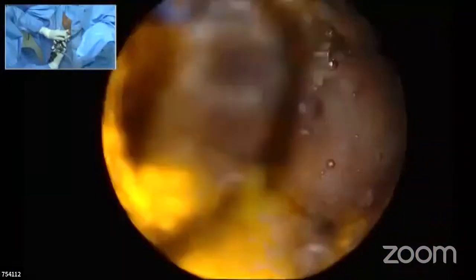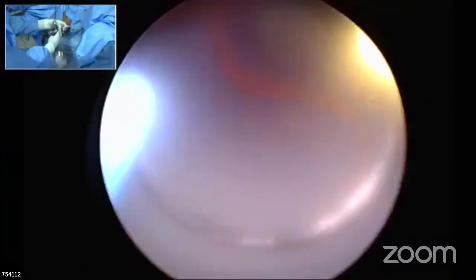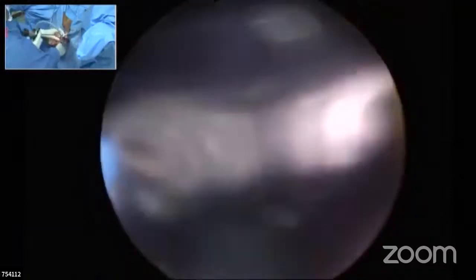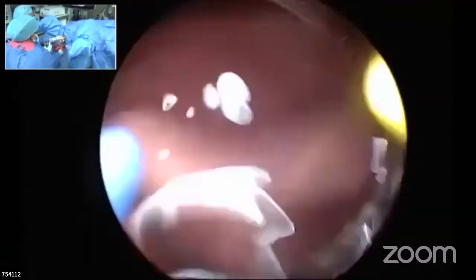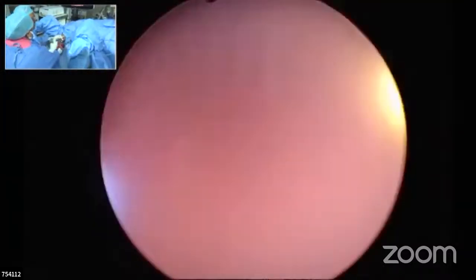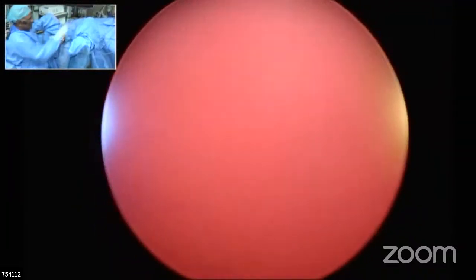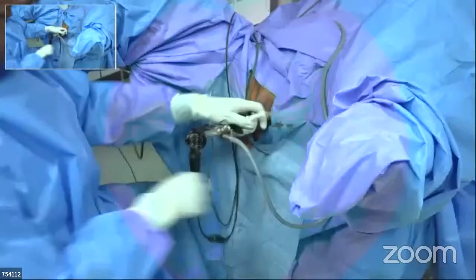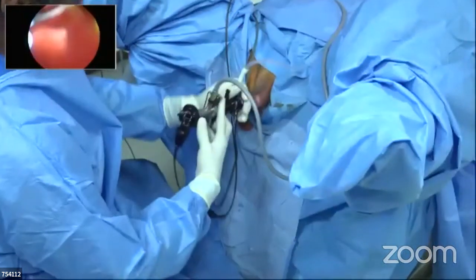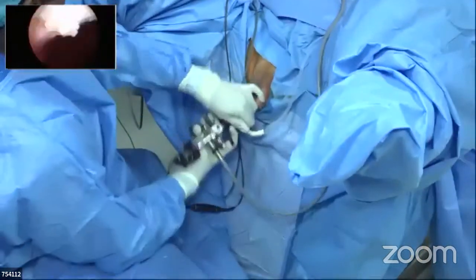But I think all of us work with a mobile camera. Do we? No, most of us. Sir, Kirpekar sir, everyone uses that Storz camera and tries to rotate it with the left hand. This is an Olympus camera. It's the only pendulous camera which can move and stay in its position even if I move. You see this? Even if I move, it stays in the same position. That is there only in Olympus, nowhere else. This pendulous camera is the proprietorship of Olympus.